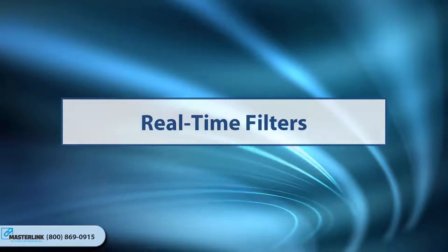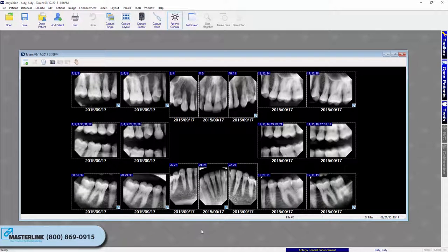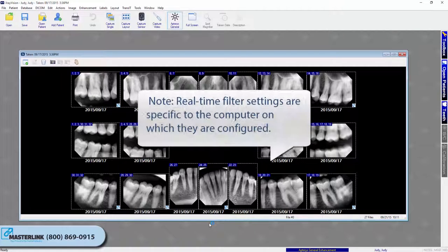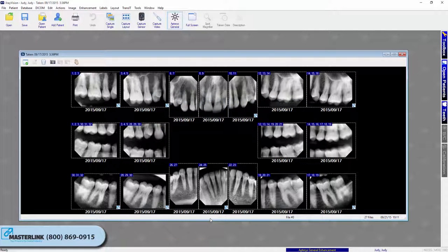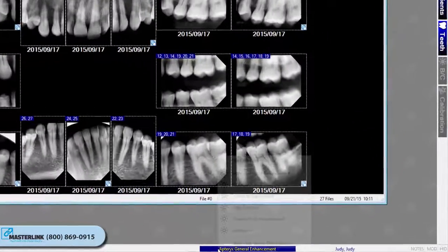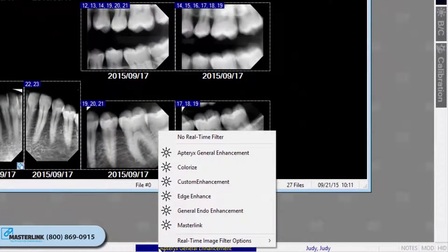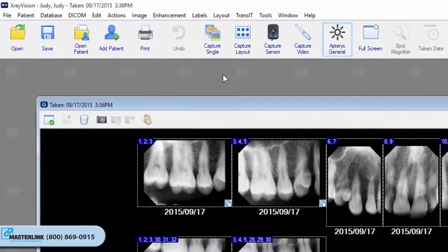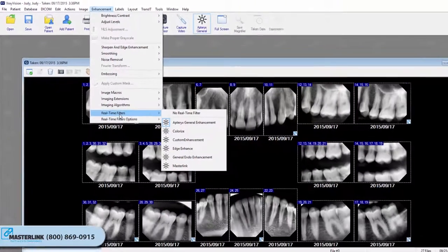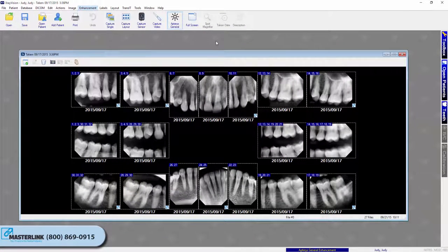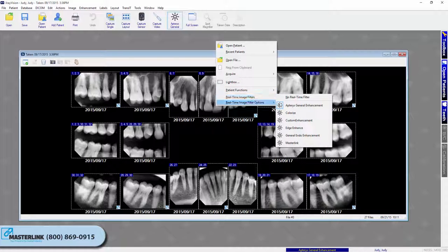Real-time Filters. Real-time filters are sets of image enhancements applied to any image that is open, but are not saved to the raw images. The filters can be turned on and off at the user's discretion, and certain filters can be customized to perform varying levels of enhancements. Real-time filter settings are specific to the computer on which they are configured. Open a patient's image layout and left-click on the Real-time filter button on the status bar at the bottom of the program. The selected image filter displays on the status bar when it is enabled.